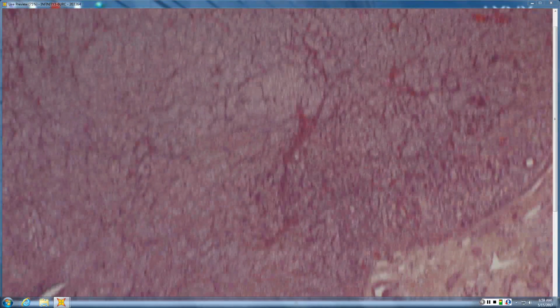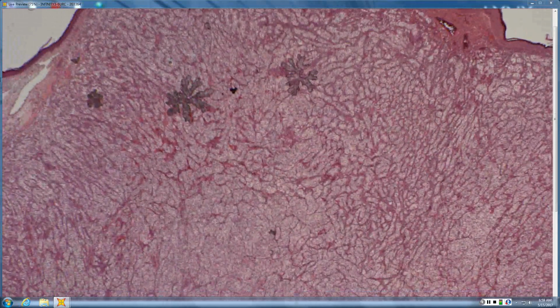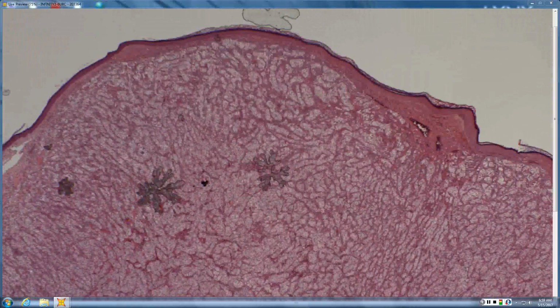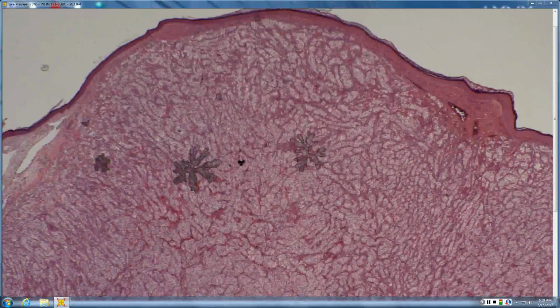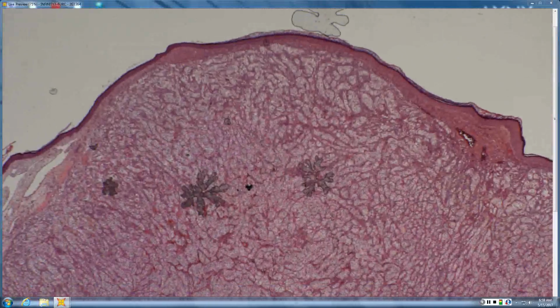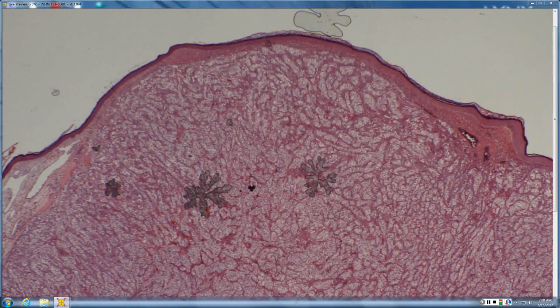This one is certainly a clear cell proliferation, and from studying throughout derm residency, pretty quickly on, you're like, oh, it's renal cell, metastatic renal cell, but it certainly could be other things as well. There's the balloon cell nevus, which can look very, very similar to it, and I want to say both are CD10 positive, actually. I mean, it can be confused with other things. There's clear cell melanoma. There's other entities too that we don't do as much in derm, but certainly in derm path that I learned about that are scary.